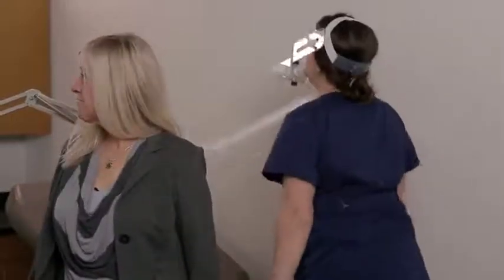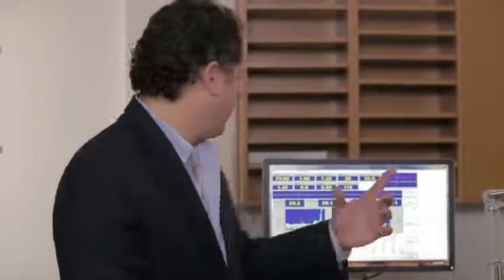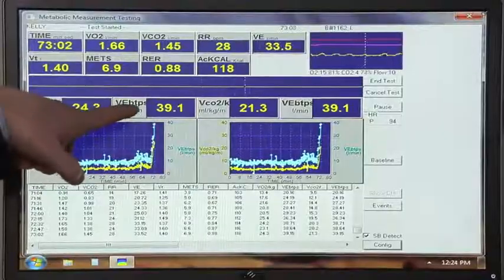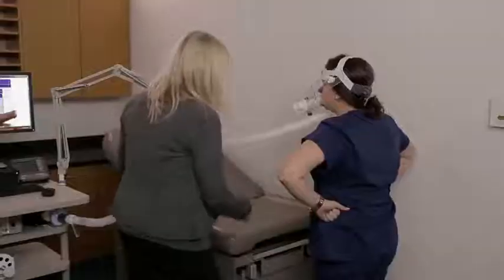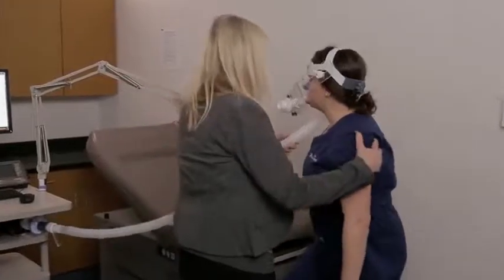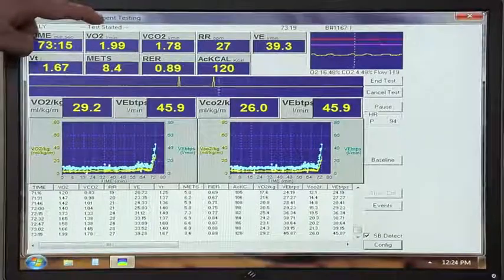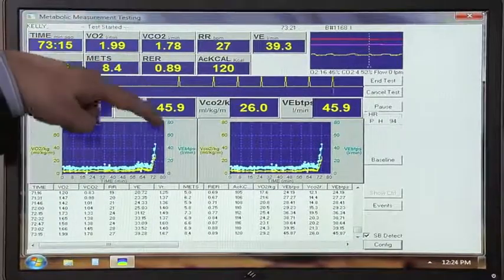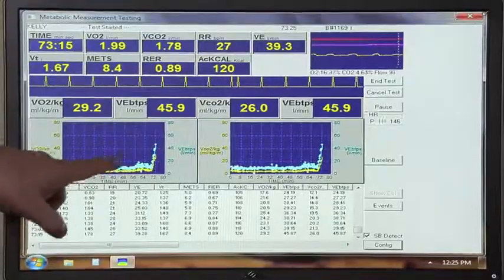I think we've stressed Stephanie enough. Now we can watch her recovery — her metabolic rate should lower because she no longer needs energy or adenosine triphosphate at the same production rate. So let's watch the post-exercise oxygen consumption and watch it go back down closer to where it was at baseline when we started.